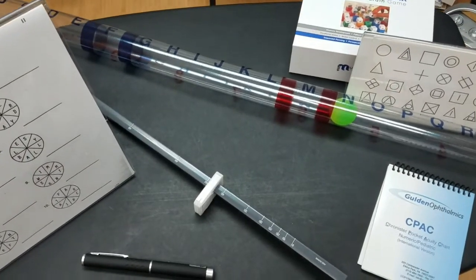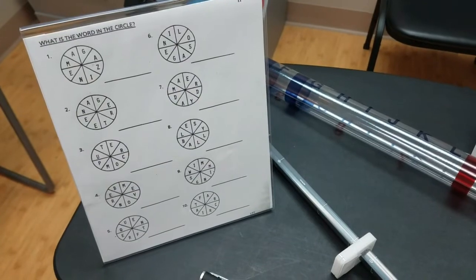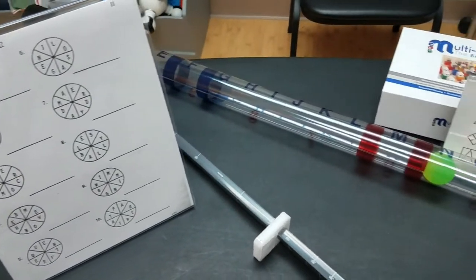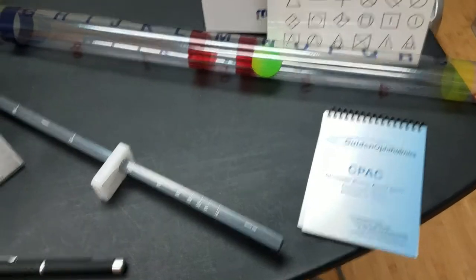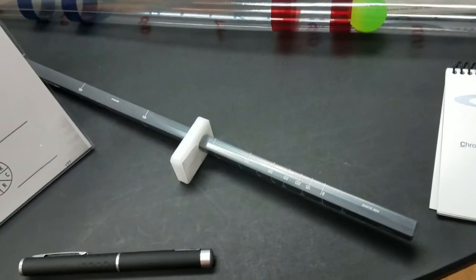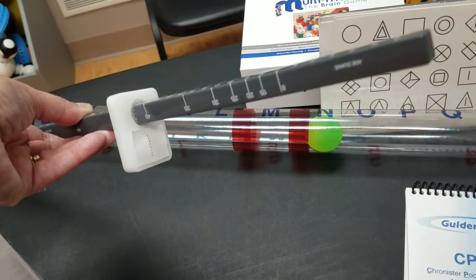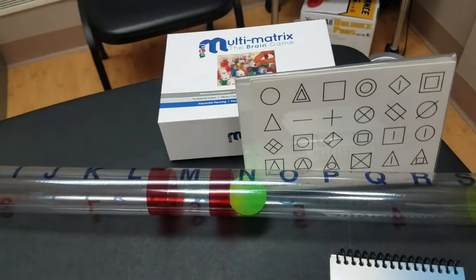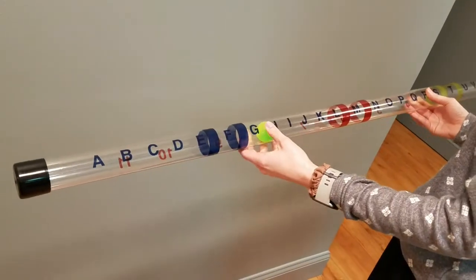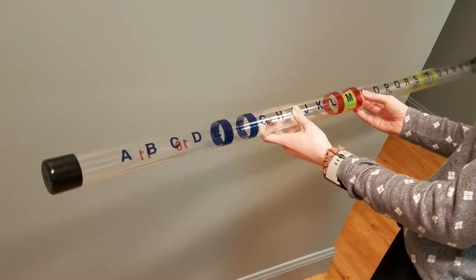Here we have word circles, a laser pointer, a near point rule, an acuity chart, the multi-matrix, and a tracking tube. All of these items can be used for either assessment or for treatment. The near point rule will give you measurements when you're checking for convergence and accommodation. The tracking tube, as shown in other videos, is used for treating pursuits.